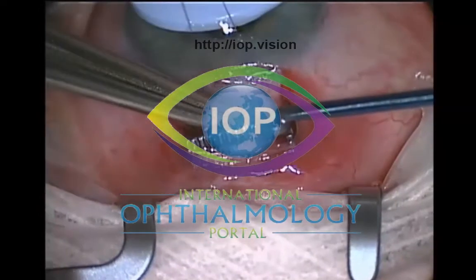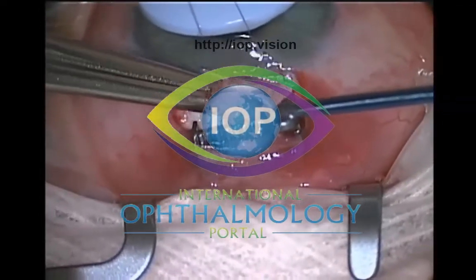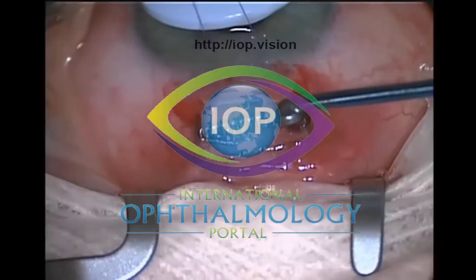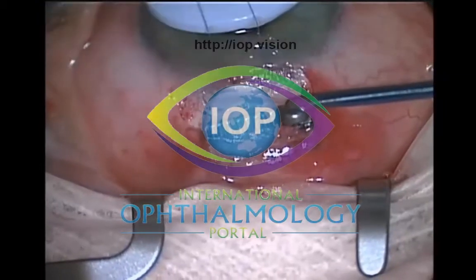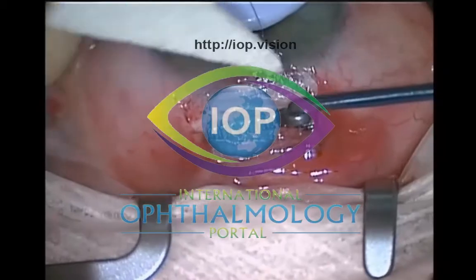Yes, I mean, again, I like your clamp a lot. I would really emphasize what you said about not using crushing clamps. I think when you do use a crushing clamp, you really do damage the limbal tissue, and that can lead to avascular and thin areas on the bleb post-operatively. I like your technique.